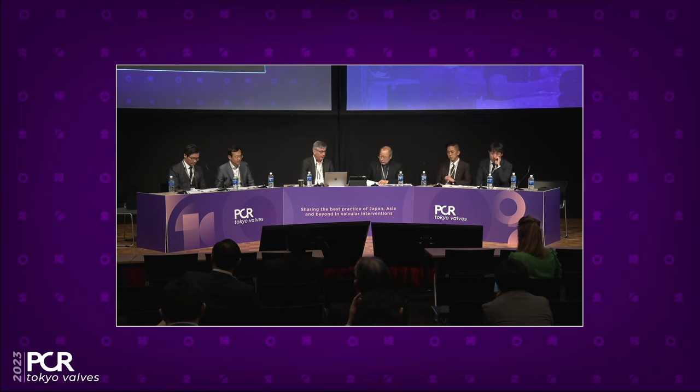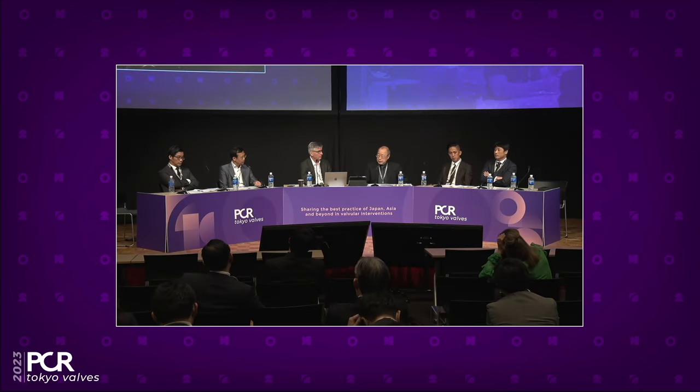So, Dr. Saito, it can be difficult to access the coronary arteries after a TAVI procedure. Any tips and tricks, such as using non-standard catheters or guidewires, to do it? What is your practice if you face difficulties? Of course, I usually start from a 6-French guiding catheter, like EBU or short JL, JL short tip, JL 3.5 or even 3.0. And sometimes I take a 5-French guiding catheter. It's more useful and controllable.